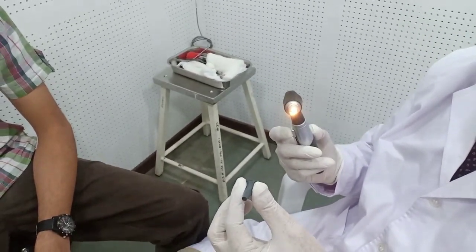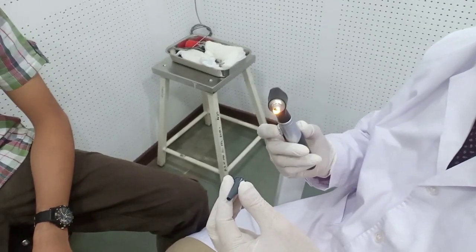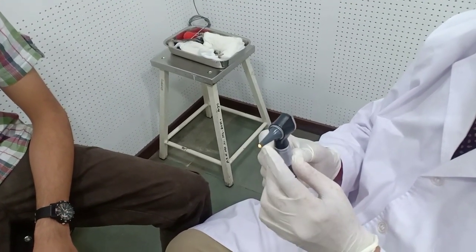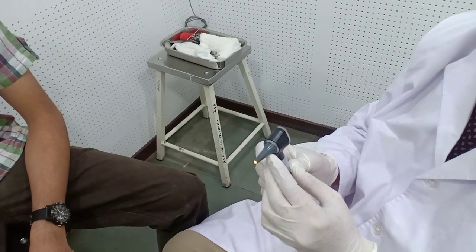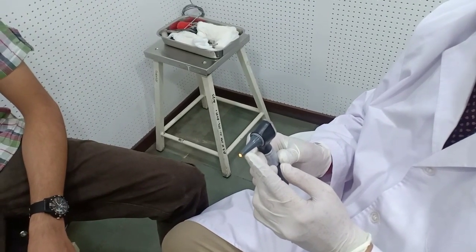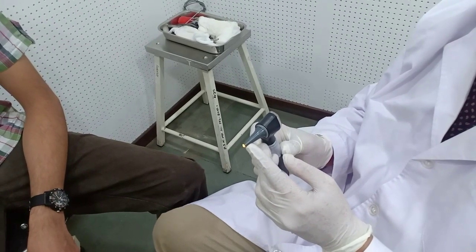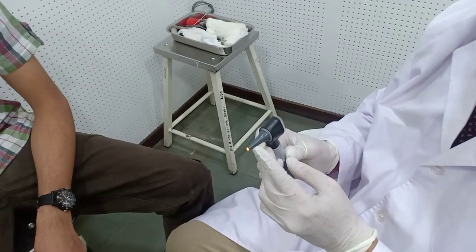Now this ear speculum should be the largest one that can go easily into the external auditory canal. We should keep in mind that the tip of the speculum should not touch the bony part of the external canal, because the bony part is very sensitive and it will be painful and the patient will not allow it, and especially in children they will shout. So this tip should not go beyond the cartilaginous part. It should remain only up to the cartilaginous part. That we should take care.